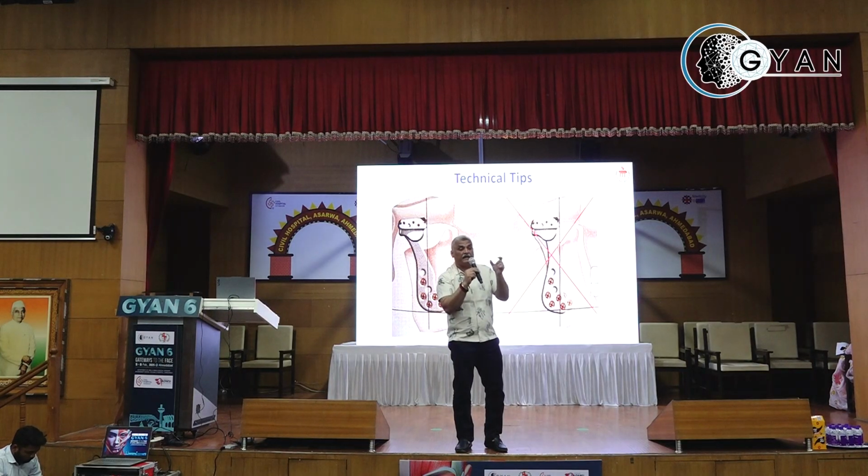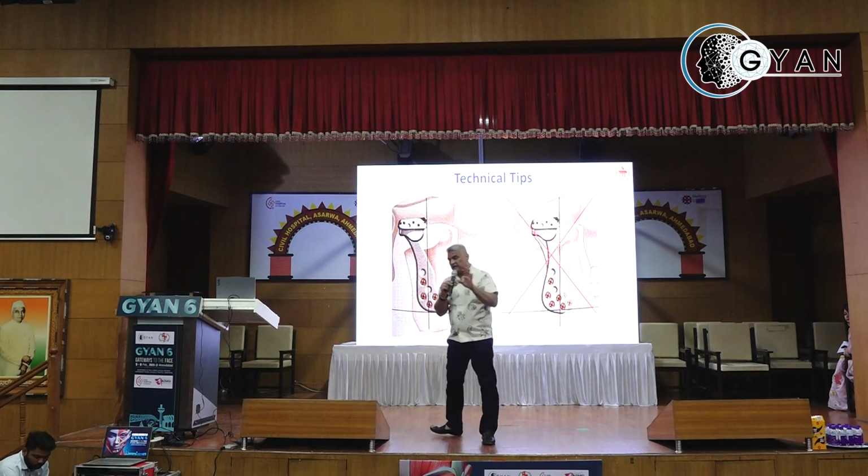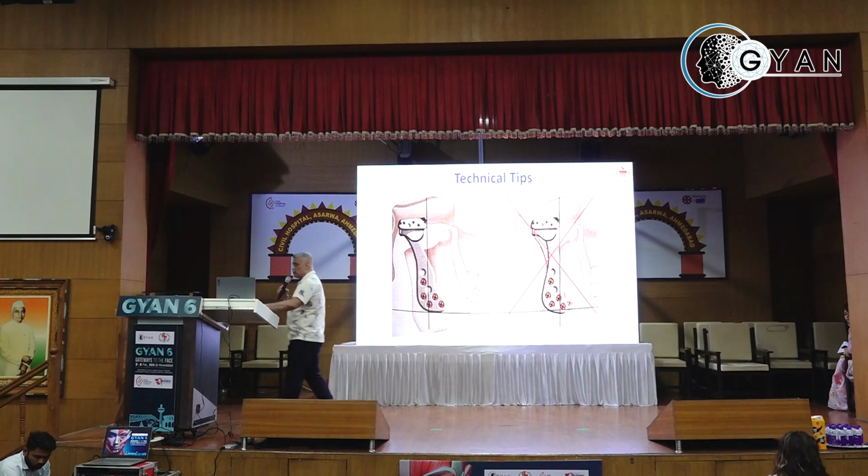The condyle is barrel-shaped because they claim to have translatory as well as rotational movements happening within the joint for the patient. If you go back to literature where Maurice Mommaerts from the European school says he tries to suture the muscle, that's the lateral pterygoid, to an aperture which is created within the joint so that the patient has lateral excursion and protrusion movements. I really don't know how that happens, but this is from a surgical point of view.